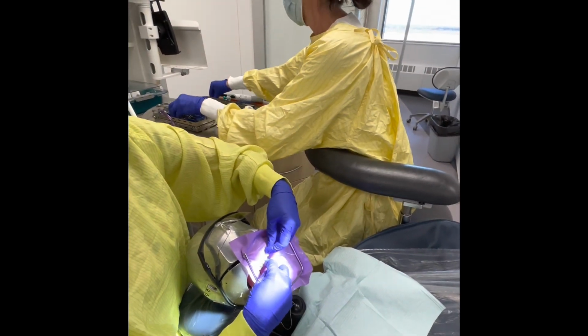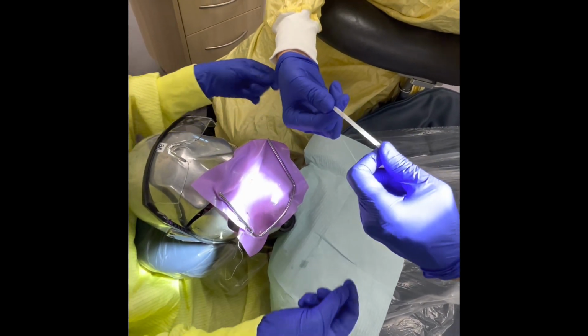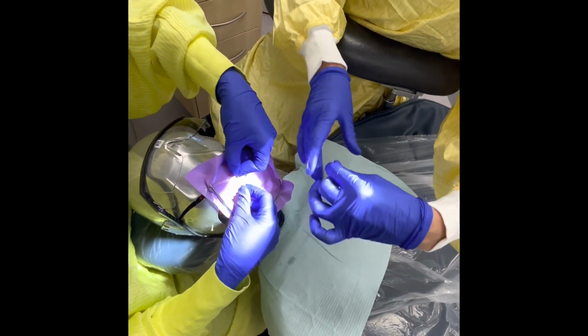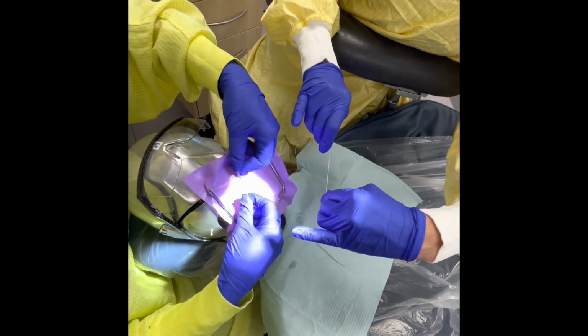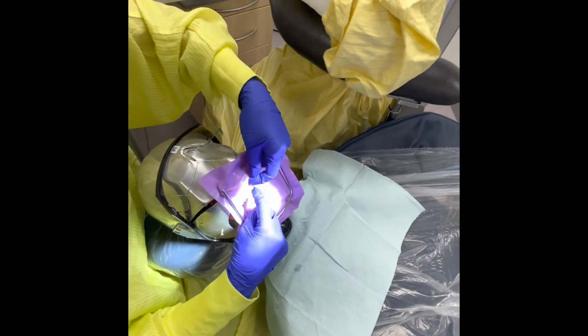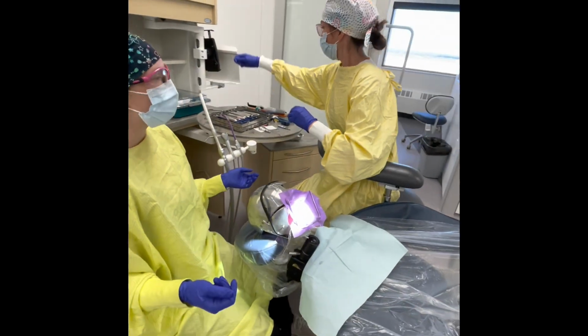Oh, it's a little rough, Stacy. Is it? Okay, I will give you a sandpaper strip then. So again, two-handed floss for the sandpaper strip. Then Stacy's going to flip her floss around and get ready to transfer it again. Take the strip and give me the floss. And how's that? That is perfect. Excellent. Okay, we are ready to restore the posterior.